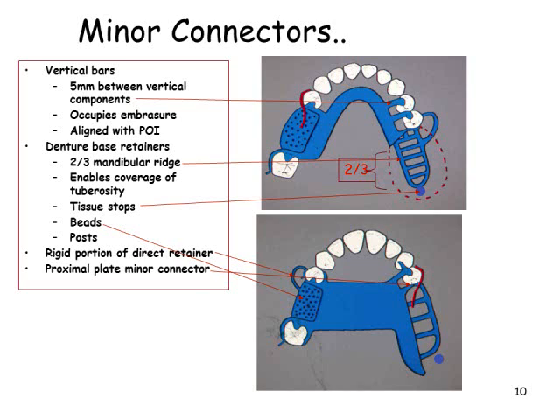When an artificial tooth will be placed against a proximal minor connector, the greatest bulk of the connector should be located toward the lingual aspect of the abutment tooth. In this manner, sufficient bulk is assured with the least interference to the placement of the denture tooth. Ideally, the artificial tooth should contact the abutment tooth with only a thin layer of metal intervening buccally. Lingually, the bulk of the minor connector should lie in the interdental embrasure the same as between two natural teeth.